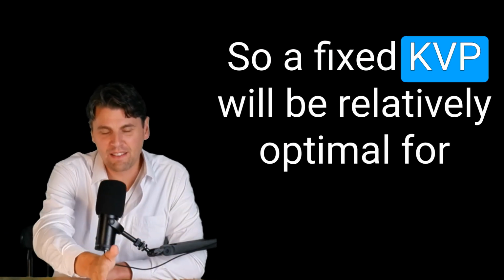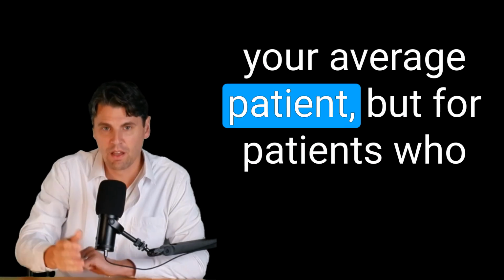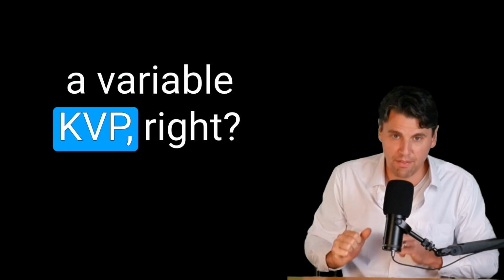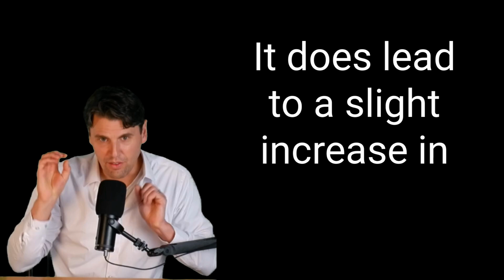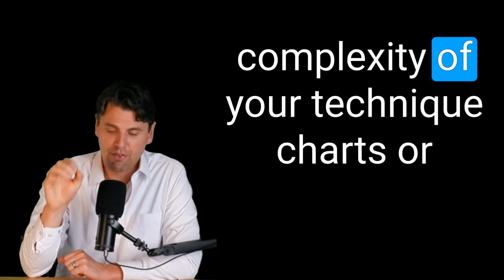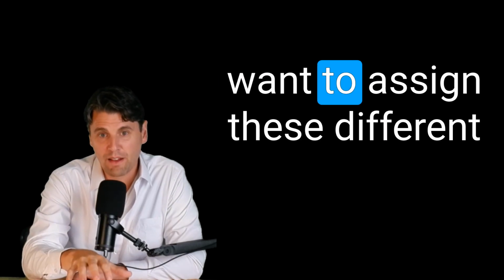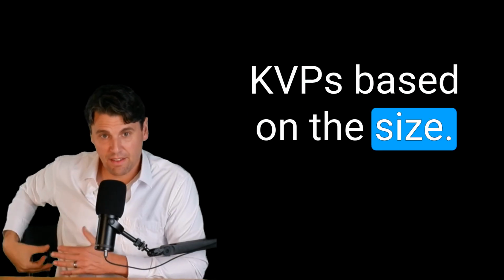So a fixed KVP will be relatively optimal for your average patient, but for patients who are smaller or for patients who are larger, actually being able to use a variable KVP will help you to optimize the dose for those patients. It does lead to a slight increase in complexity of your technique charts, or essentially your lookups for the way that you want to assign these different KVPs based on the size.